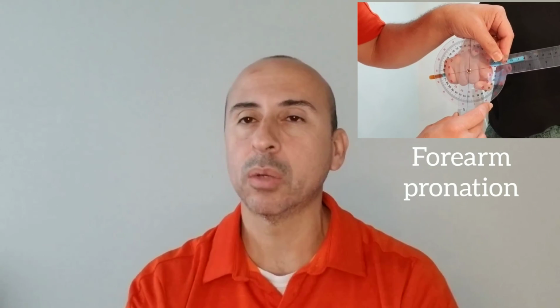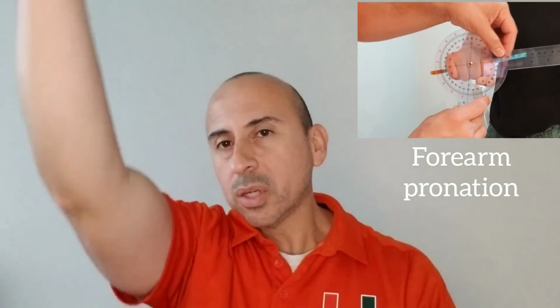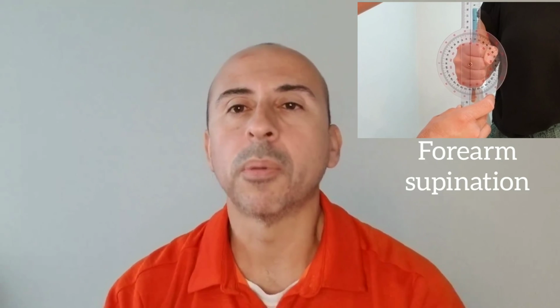I mean, I've had a student once going into shoulder flexion and then have the patient's hand just kind of plop them in their head. Obviously, the person didn't get hurt, but it's little things like that students don't usually anticipate, which you want to be careful with, for quality of service or potential injuries, and just general standard practice purposes.